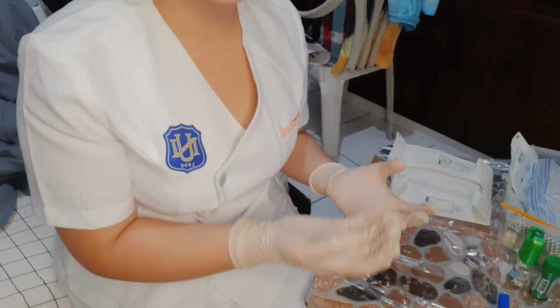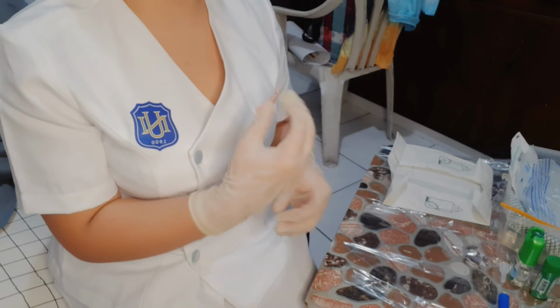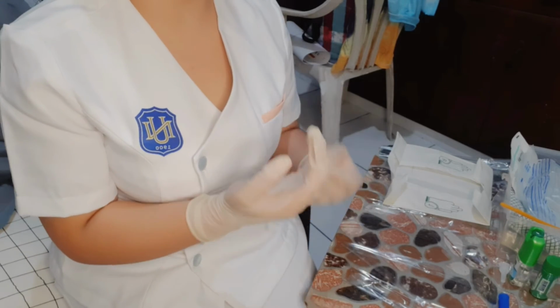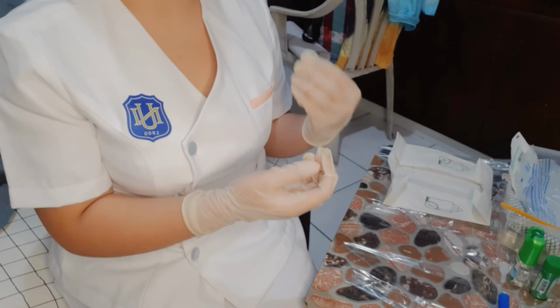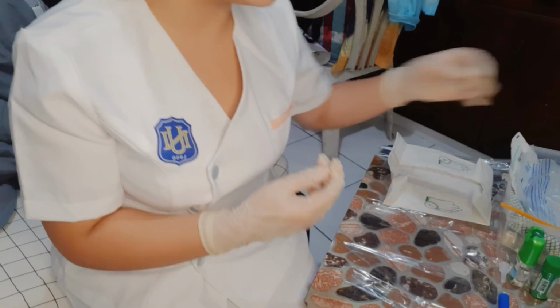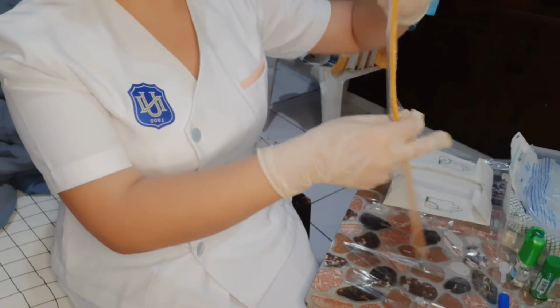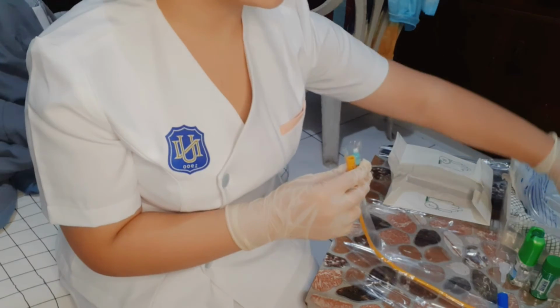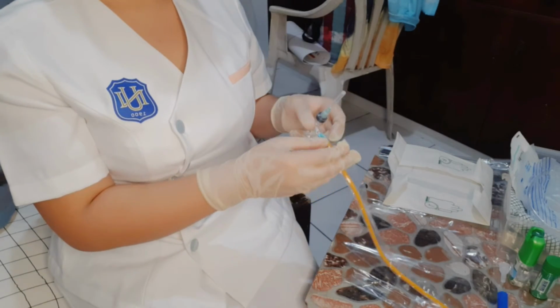So I have it here, the catheter in 14 size, and of course the 10 ml syringe, including the normal saline. So I'm done donning gloves, which is to reduce risk of contamination from microorganisms. So the next is you will attach the prefilled syringe to the indwelling catheter inflation hub and test the balloon. So I have here the catheter in size 14 for adult, and then the 10 ml syringe.